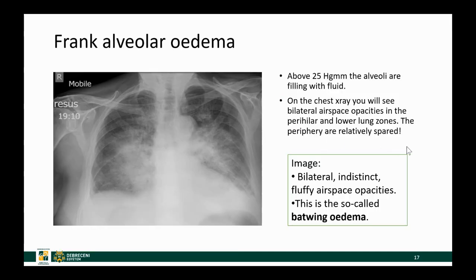When the pressure goes even higher, above 25 millimeters Hg, the alveoli will get filled with fluid and you will see the batwing edema — a fluffy, bilateral, central type of haziness or opacity that spares the periphery. This is very bad news for the patient when you see this chest X-ray.